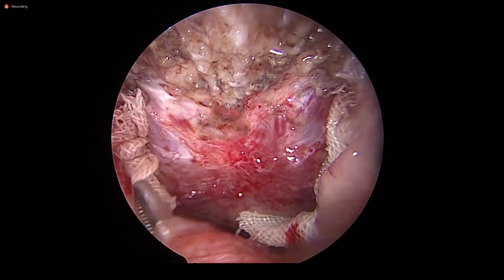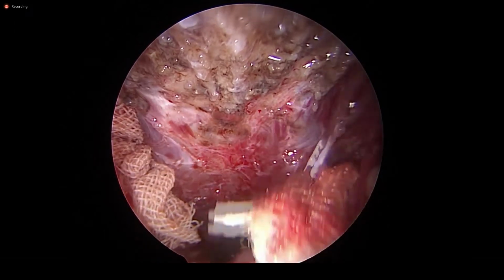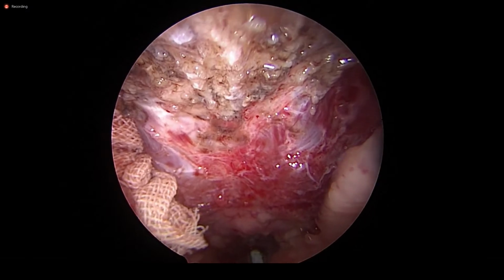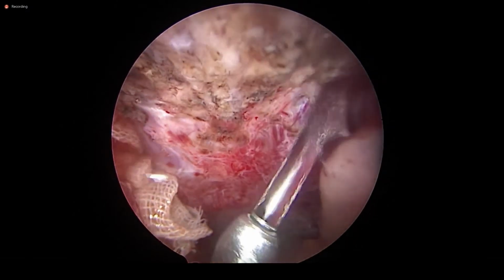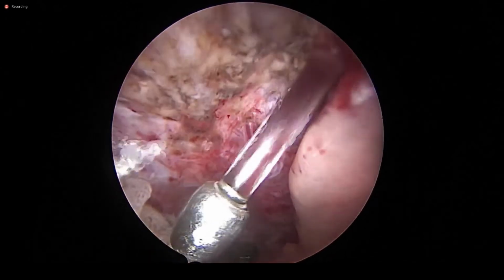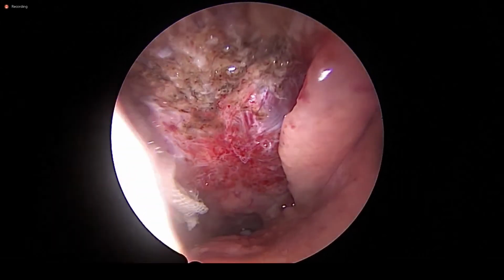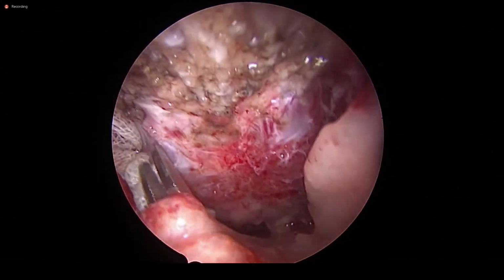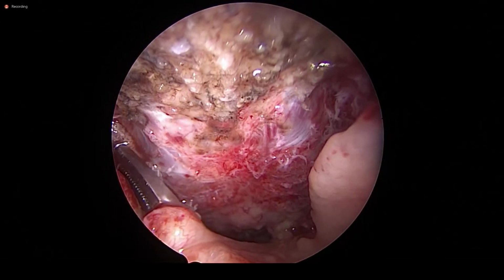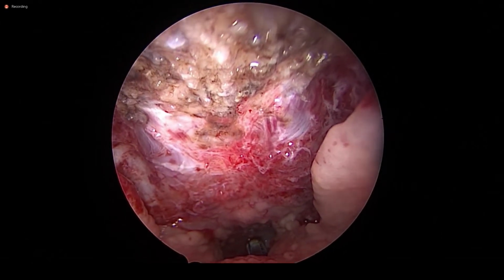See this. Now, I have a question. Panoramic view, can you show the eustachian opening? Panoramic view, now you can see. This is a comprehensive adenoidectomy. The adenoids cannot come back. It is not a tumor.